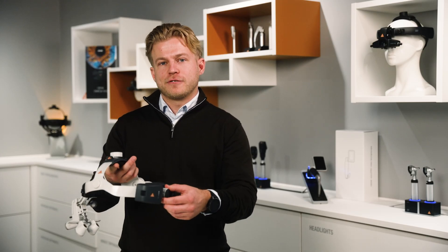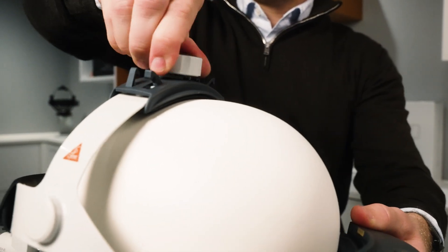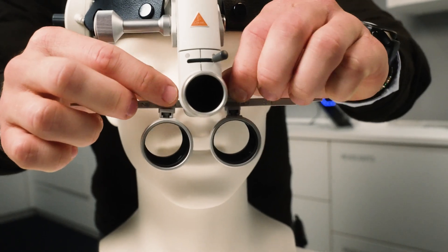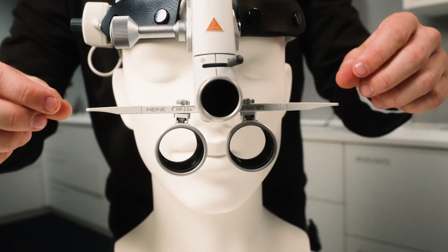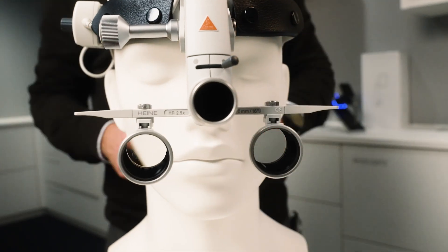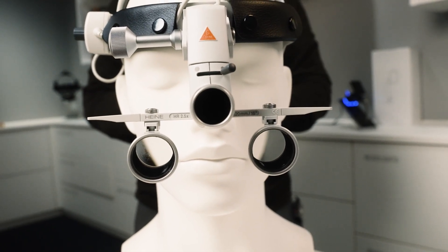These two rotary knobs are for adjusting the headband to get a good fit according to your head size. These two screws hold the right and the left loop in place on the loop carrier rail — they can be adjusted very flexibly. Loosen the locking screws of the loops, then move each loop to the outermost position. Don't tighten the screws yet.